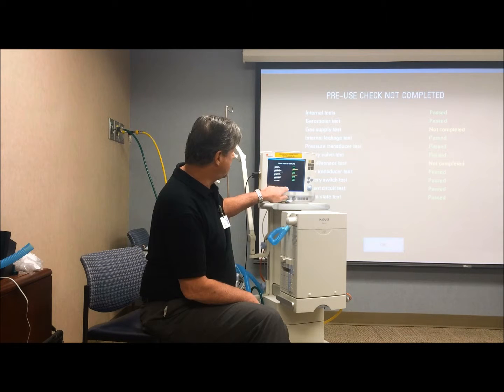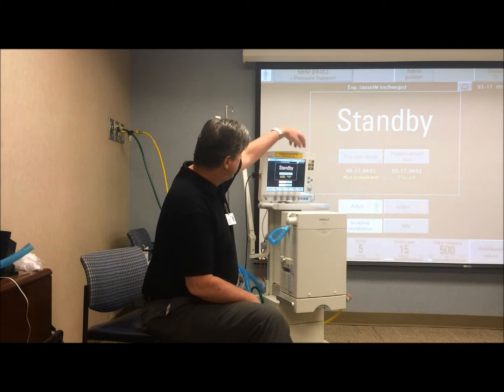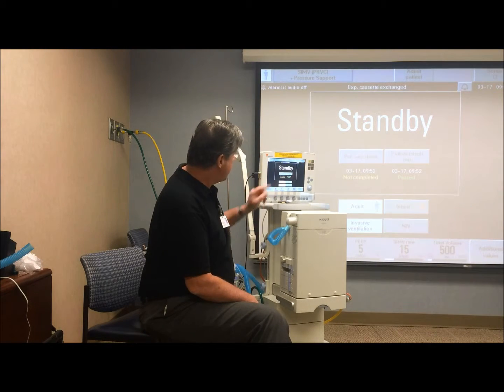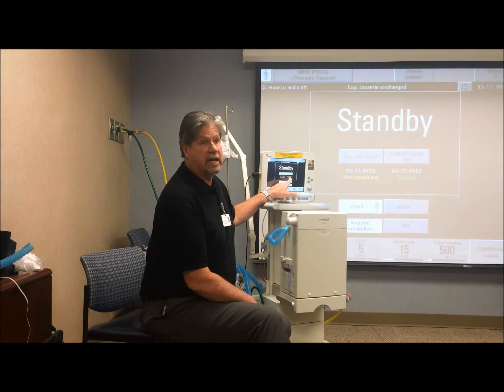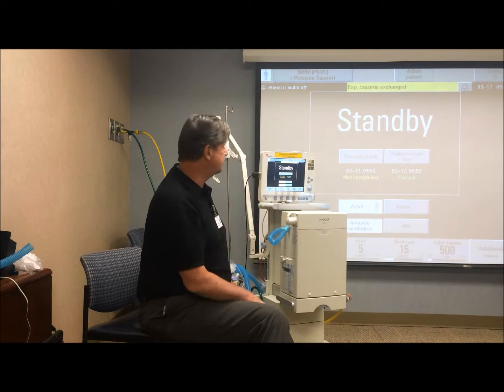Okay, so I say okay, and you want to delete data, trends, and event log, and we typically say yes. The message comes up again, so I silence that. But still I get "not completed," but the patient circuit test passed, right? Because all that is just doing that compressible volume deal.